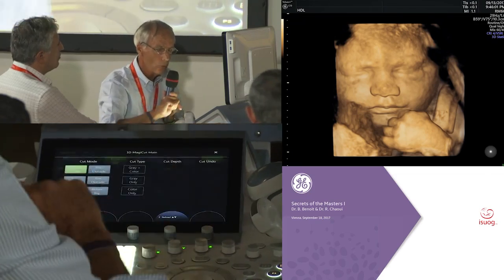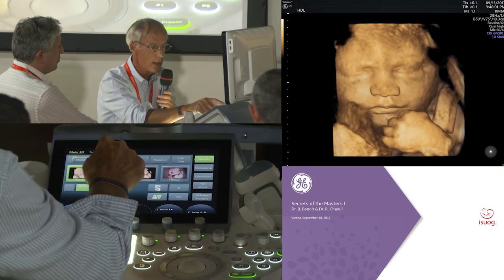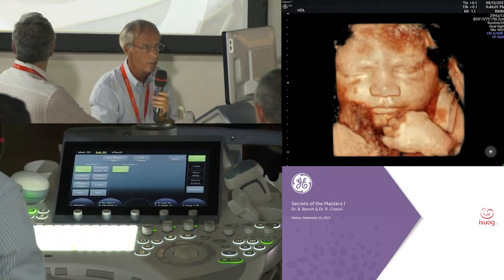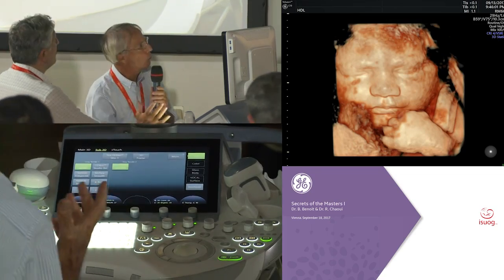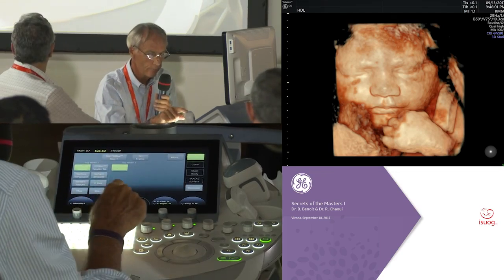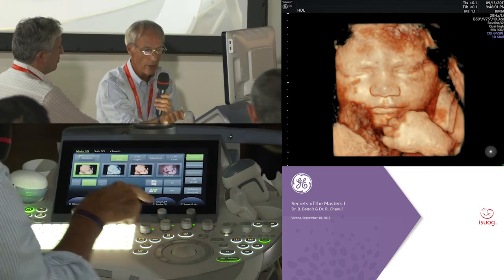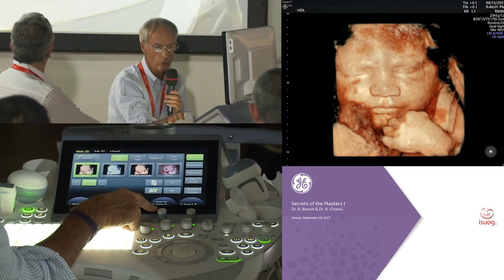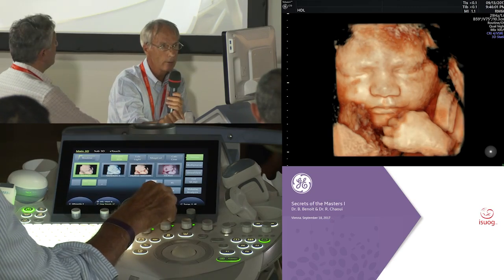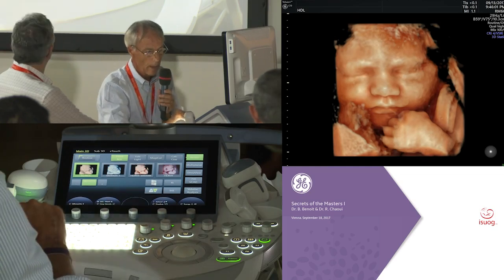And what we use now is HD Live. I will go here, choose HD Live. But it's not really nice, not yet. You have to change some settings. First, you have to edit the shadow. Here you can see the shadow softness is 50%. If you click on it here, I will move it to a little bit more than 100.